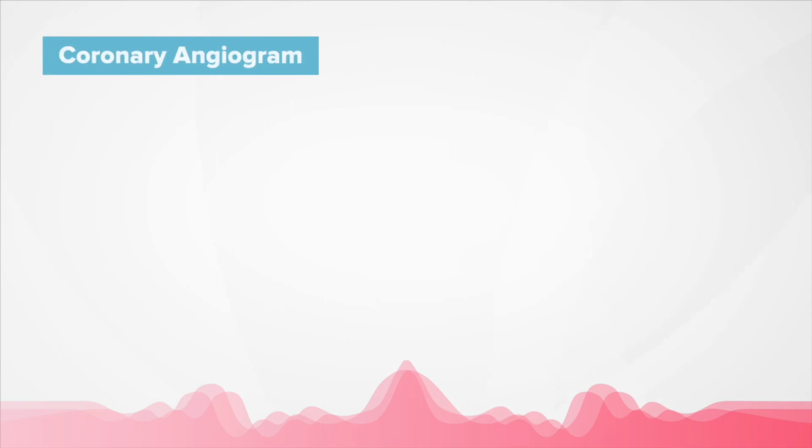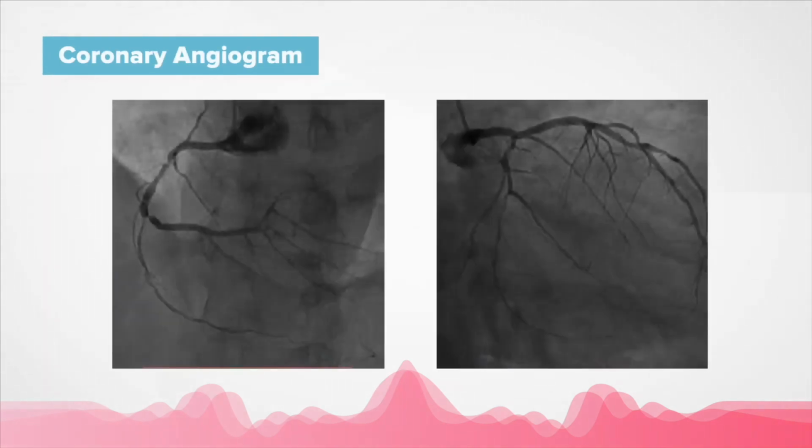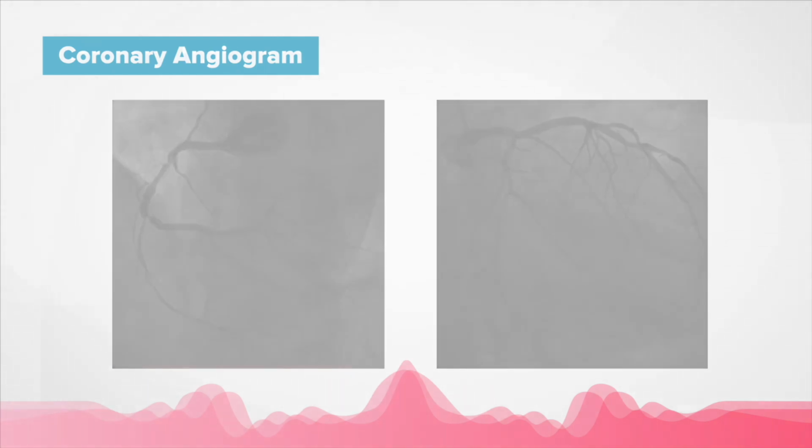The patient subsequently underwent invasive coronary angiogram, and that showed significant stenosis in the right coronary artery. And this corresponded to the abnormalities that we saw on exercise stress CMR. This case highlighted the ability of CMR to assess coronary artery disease using 4 different approaches: detection of ischemia from regional wall motion abnormalities and perfusion defects with exercise stress, detection of myocardial infarction with late gadolinium enhanced imaging, and lastly, assessment of exercise capacity.